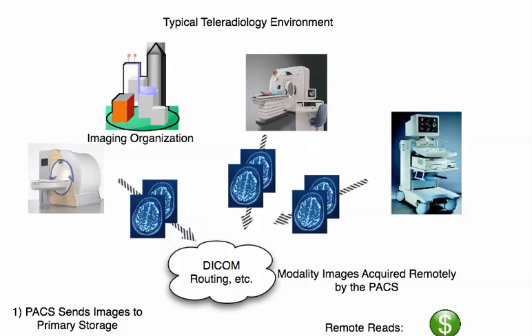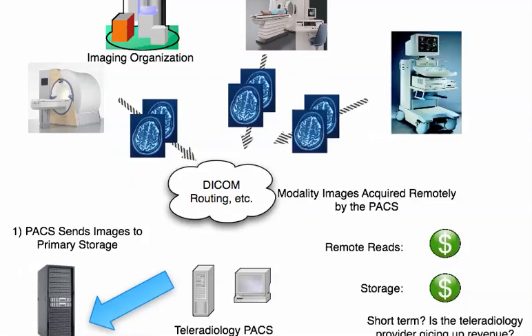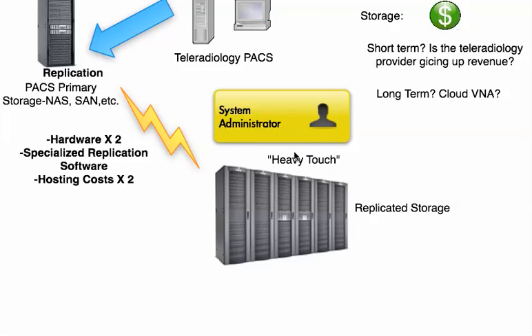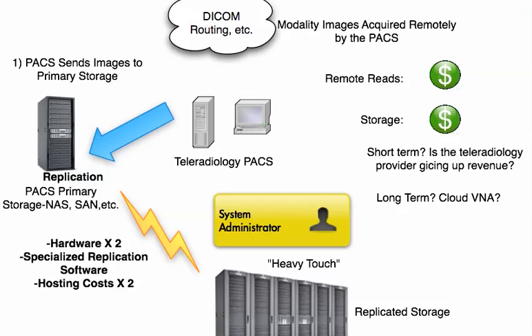We think some teleradiology companies have been doing that quite successfully, and they've made a nice little profit center out of storage. Others are hesitant, and I think that's primarily because in the past you've had this heavy touch storage environment, very expensive, both from a capital expense perspective as well as the management and administrative components. So we're going to look at some alternatives, and frankly, in the form of vendor neutral archive technology.